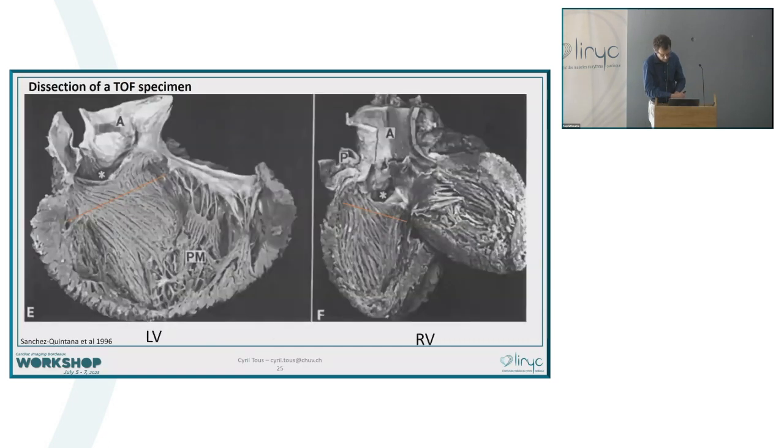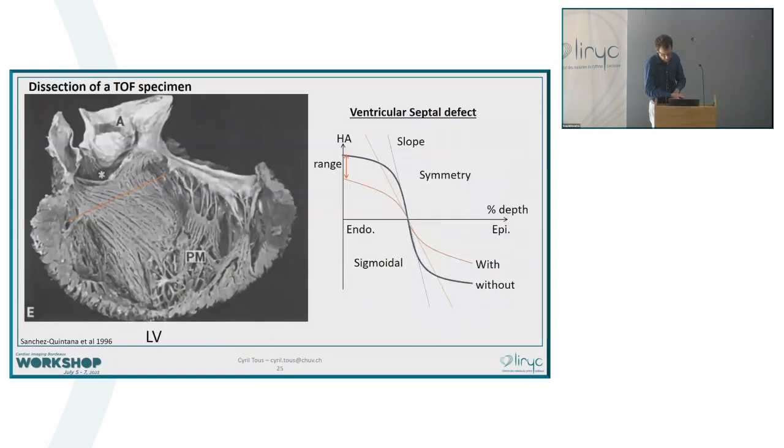And if you use DTI as well, looking at the ventricular septal defect, you can actually quantify how the fibers change through the wall thickness, and show that they actually lack longitudinal fibers, so it decreases the longitudinal shortening, and therefore the cardiac output.